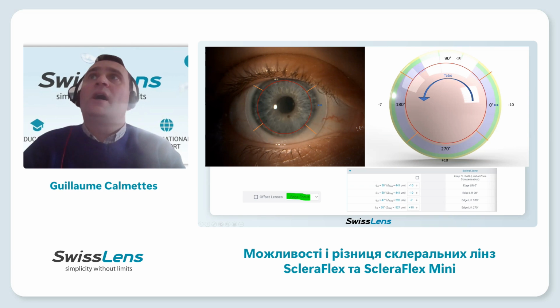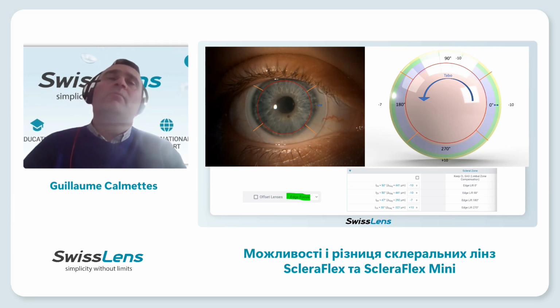So here at 0, you have -10, at 90, you have -10, at 180, -7, and here +10. It's an example. You can use it to adapt much more closely than with another option, because for some eyes it's very important to be able to have a much more personalized fitting for some patients.